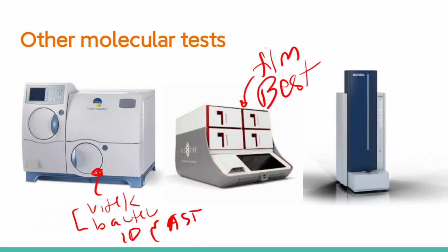Best sa pag-detect, detection na nakadepende dun sa specimen ng pasyente. Okay, so dito kasi sa film array we do panel testing.